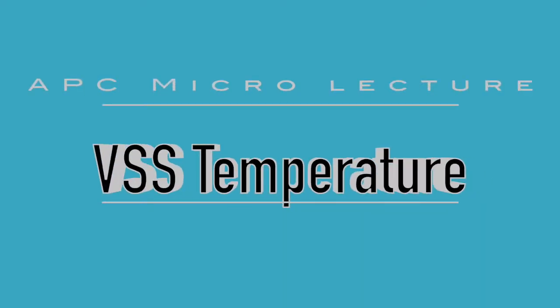Today we're going to talk about using an external thermometer to record somebody's temperature as part of their vital signs survey. So we're going to put a couple of things together. We're not going to talk solely about the process of sticking an external thermometer into someone's ear and doing the temperature, but instead we're going to put it all together. But first, let's talk about why and when we would take somebody's body temperature.